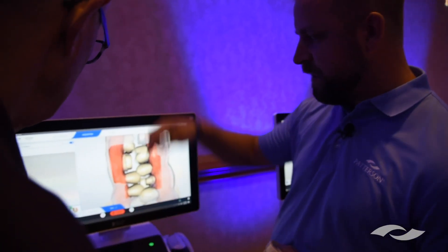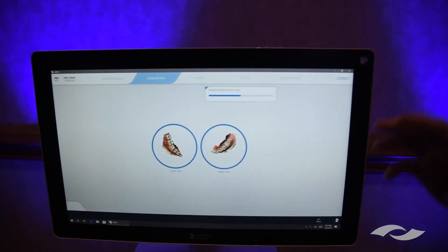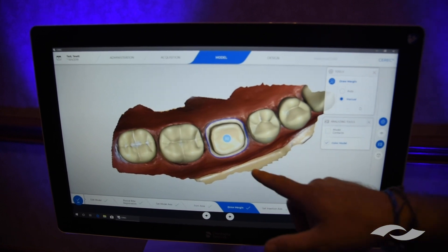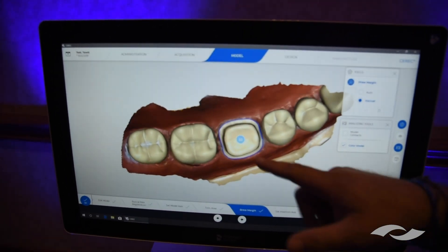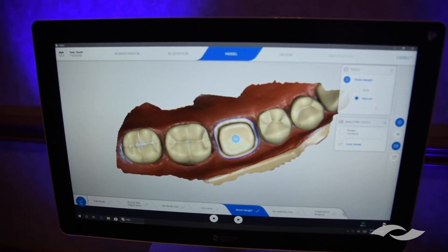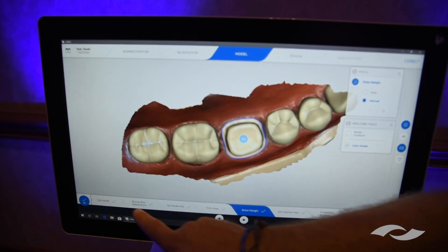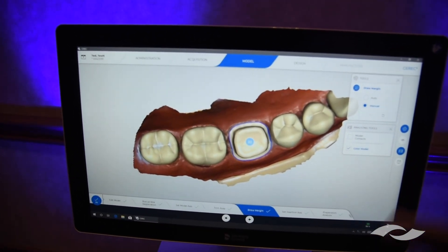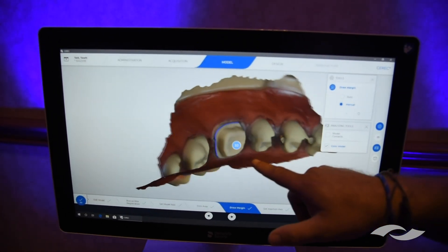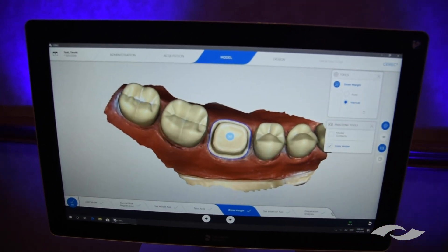Hit the forward arrow and the software will think about all the pictures you just took — it sets the model axis and insertion axis automatically. Assuming your pictures are good, it will actually trace the margin for you on the software. You can see it's already got the finish line marked on the tooth — no guesswork required. If there was a problem that was subgingival, you could correct the margin. If you were doing a bridge, you could alter pontic lines, like if you wanted a ridge lap on the pontic. In the PrimeScan software, all those steps are completed automatically if you take adequate impressions. You can also evaluate this as an impression, and trace it both ways.